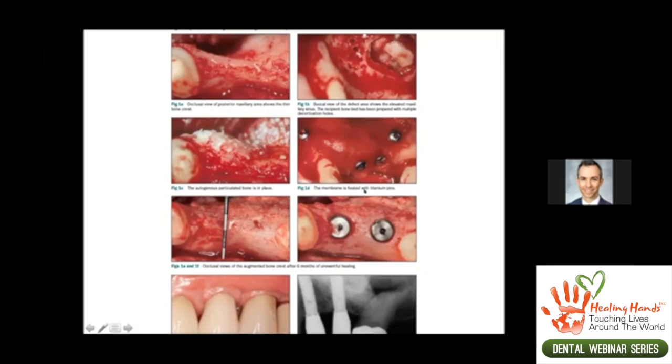I'll put my bone graft into place and then cover it with the membrane and use some membrane tacks, usually with a little mallet. We'll place those membrane tacks into place apically, mesially, and distally, and now the bone graft is completely covered, and then we close. When we come back, usually I come back 5 to 6 months after surgery and place the implant. I always obtain 3D imaging after the bone grafting to plan the implant position, and ideally, if you can do the 3D imaging with the radiographic guide that shows where the teeth are going to be, that's the best way to do it.